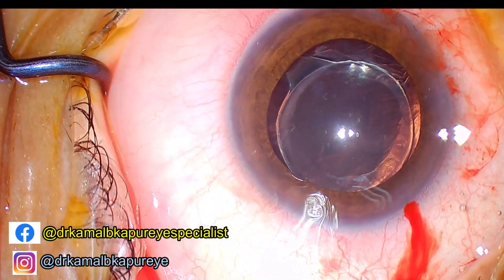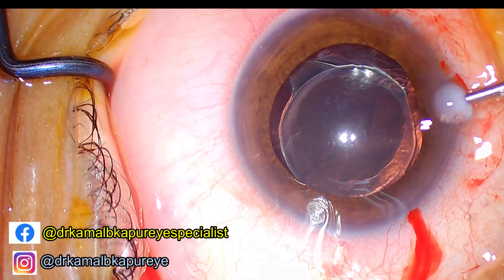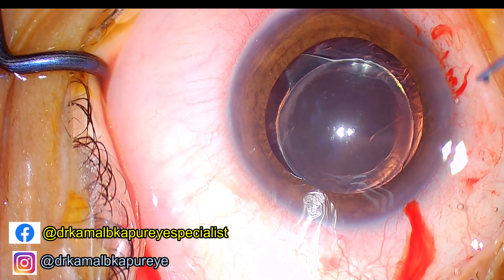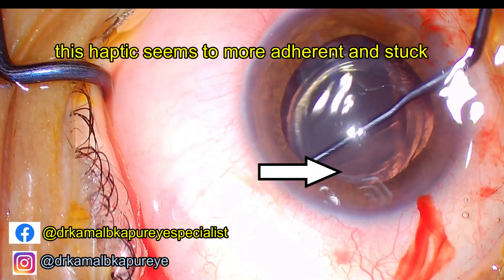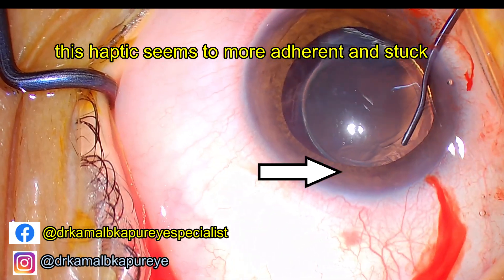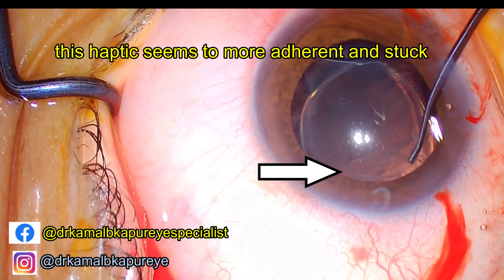Before you even start pulling the lens out, you have to make sure you are able to rotate the lens at least 30 to 60 degrees. This has to be done in a gradual manner — the dialing movement. You will notice I first make an effort, then a coupling effect from the opposite side.